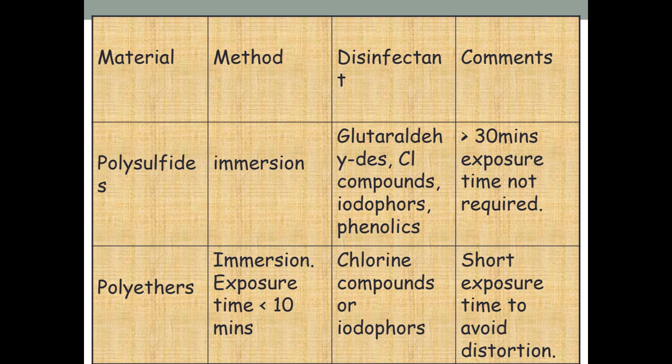Here we have different materials, polysulfide and polyether. The methods are shown in the picture, along with the disinfectant and the time for which we can expose this disinfectant to such materials.